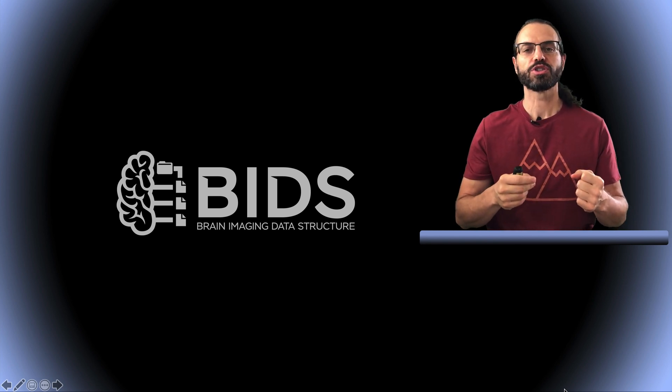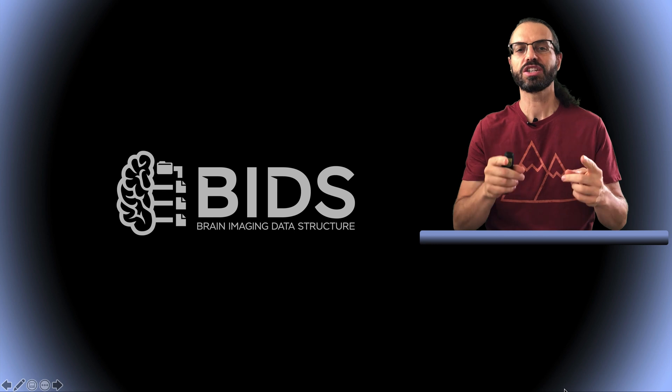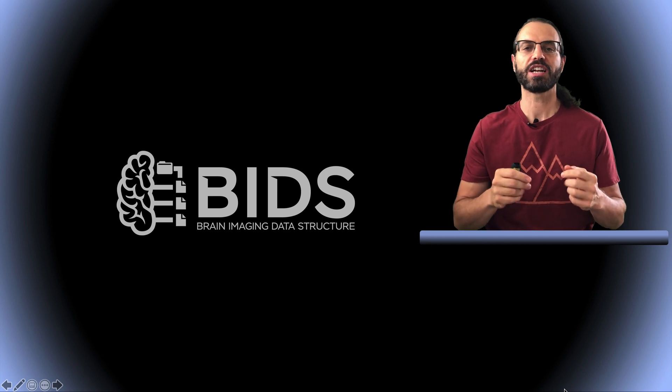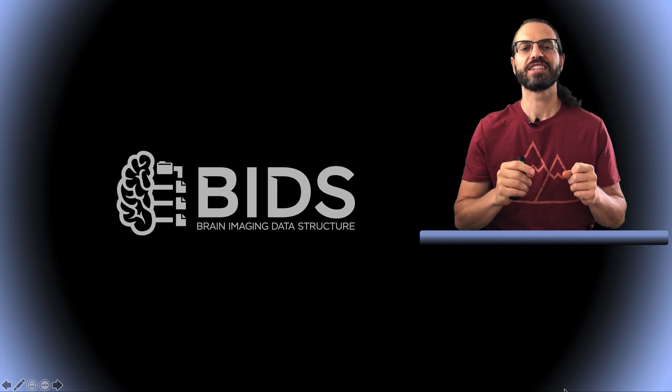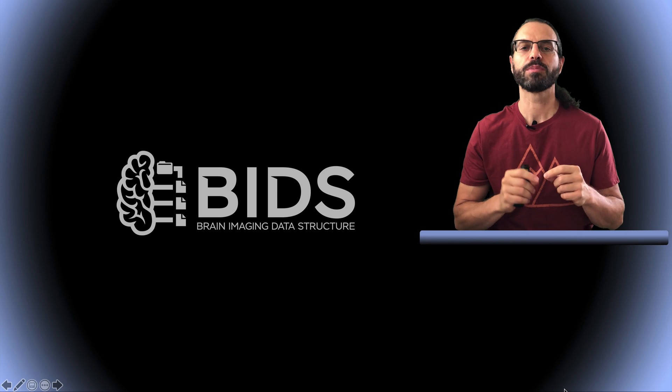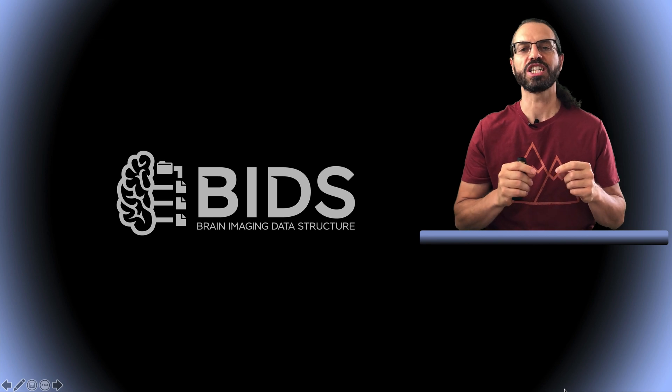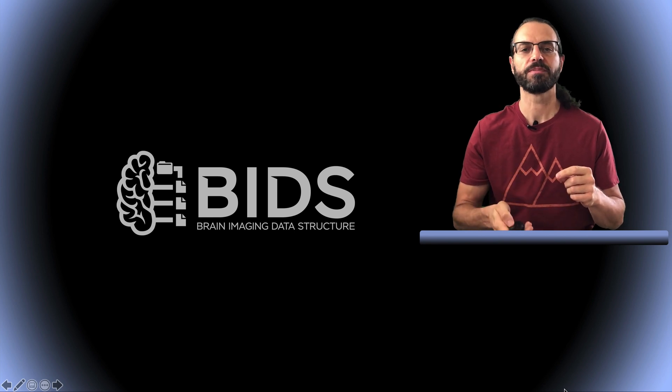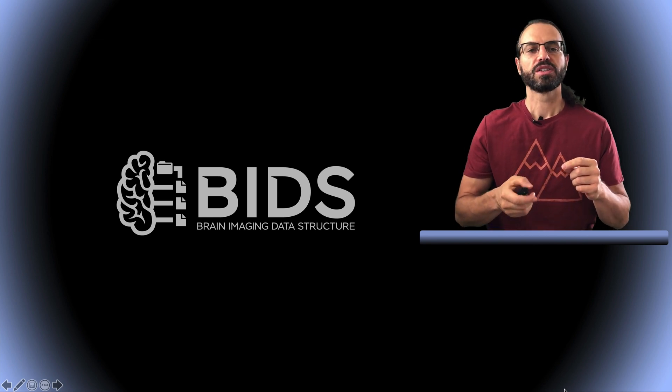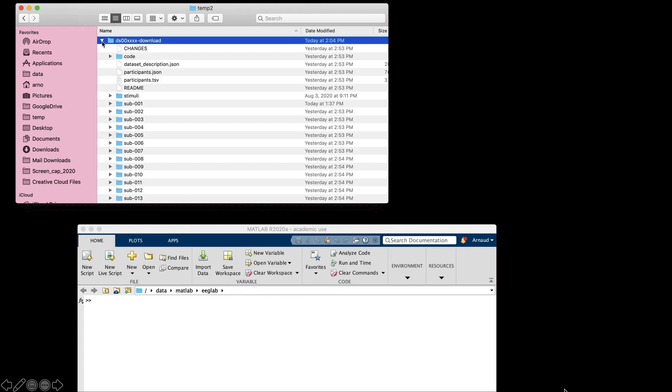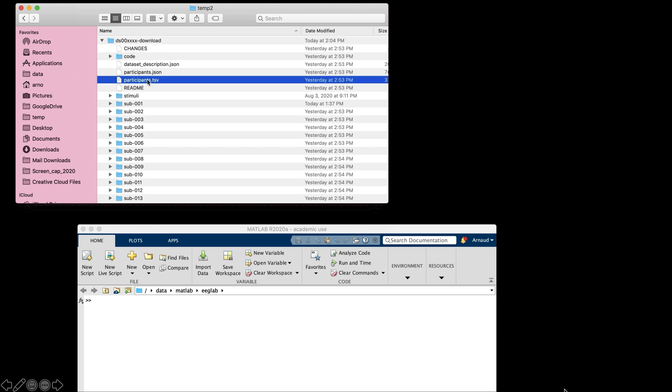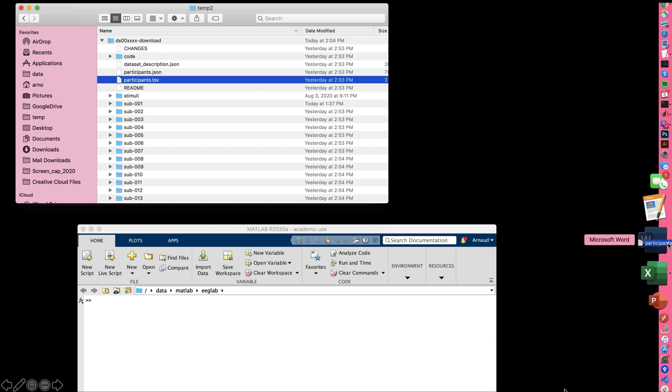EEGLAB can also import additional event and channel information contained in BIDS files that is often not available in the raw EEG data file. So here is the folder we've just downloaded, and we're going to look at some files.